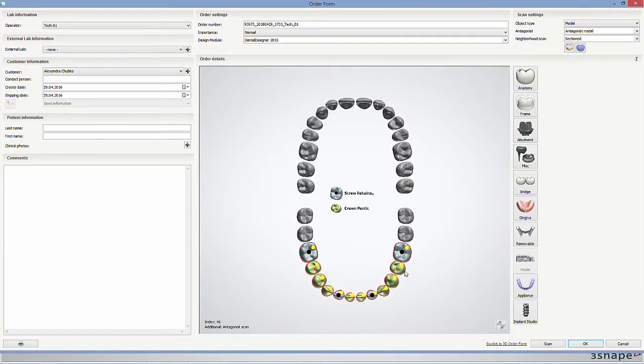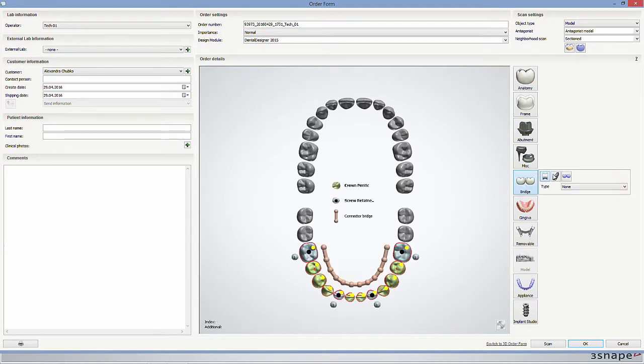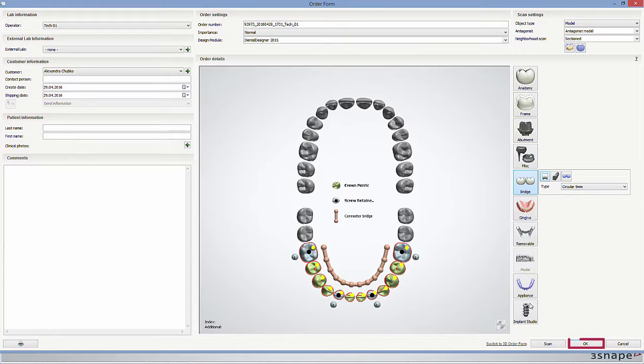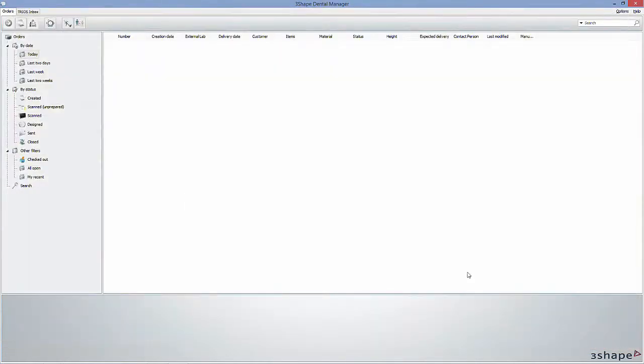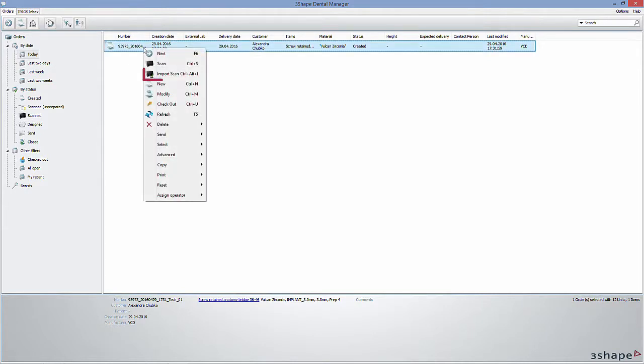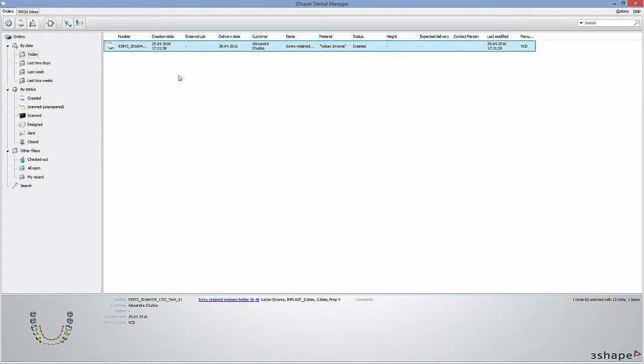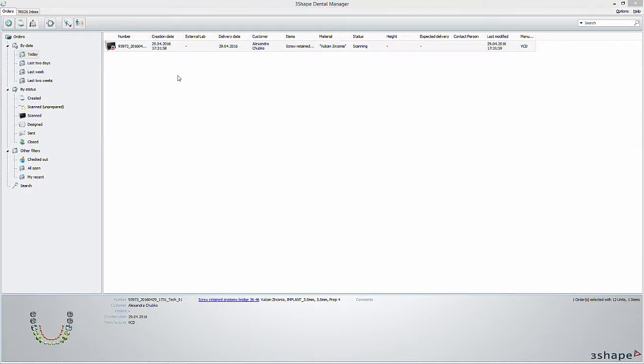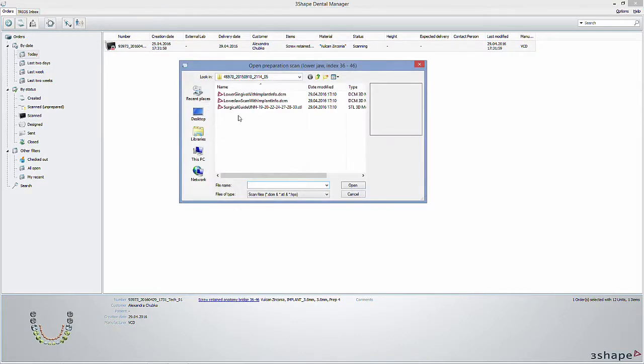When you're satisfied with everything in the order form, you can click OK to continue. You then right-click the order and click import scan. Here you choose the surface scan with the implant information from Implant Studio and click open.